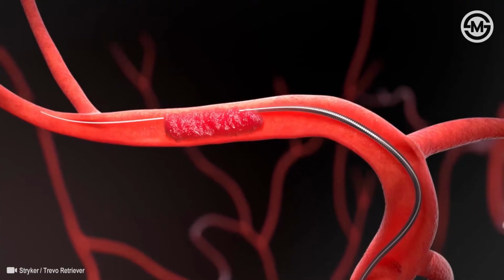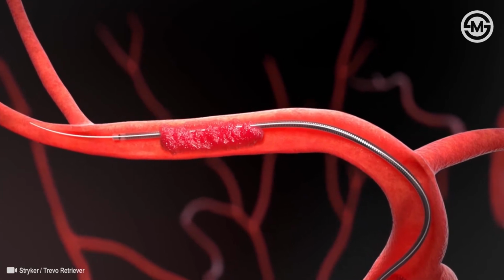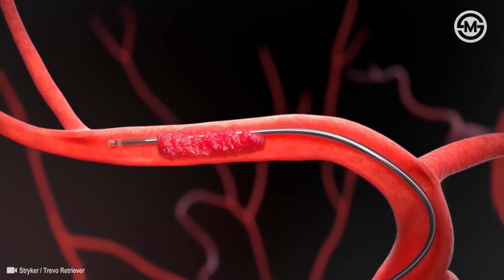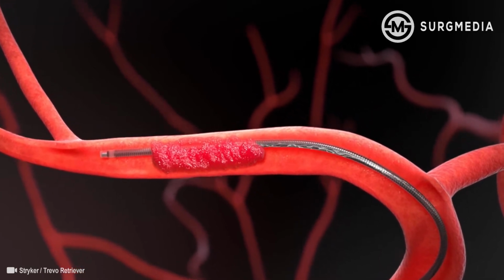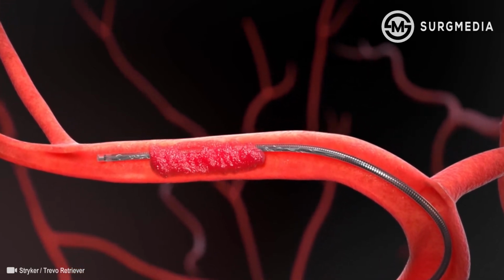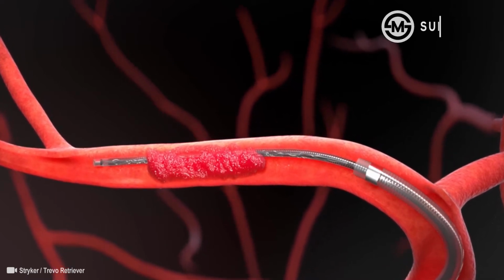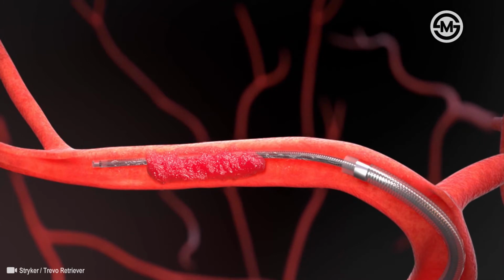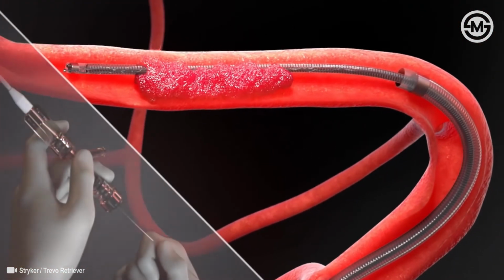With the aid of a guide wire, the microcatheter is advanced through the occlusion and positioned distal to the clot. The guide wire is then removed, and the Trevo Retriever is advanced through the microcatheter. A Catalyst distal access catheter may be advanced over the microcatheter and positioned just proximal to the clot. Unsheath the distal tip of the retriever.